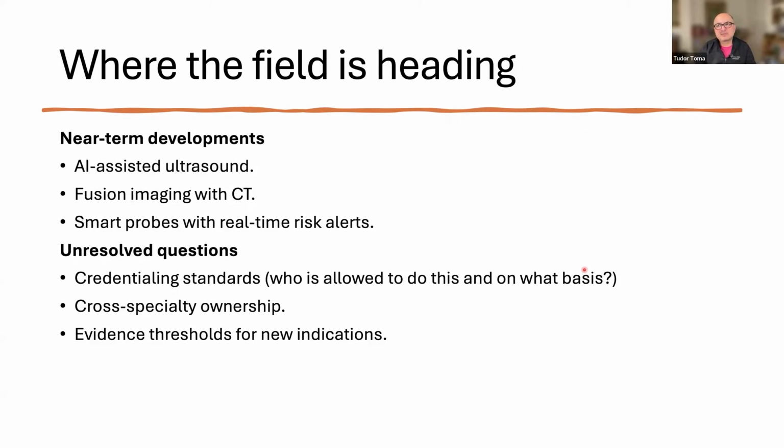I think you still need to assimilate the maneuvers and the muscle memory of how to acquire the image, and therefore a little bit of practice on a simulator after that, or even a practice on a patient in a safe environment is important. Very interesting is the fusion imaging with the CT.